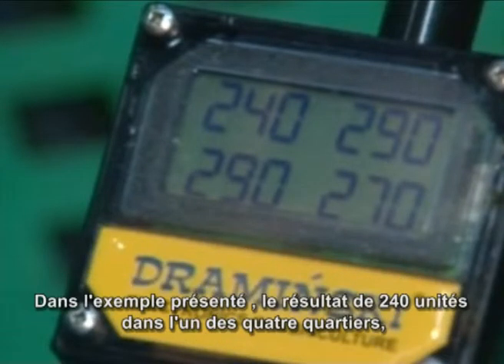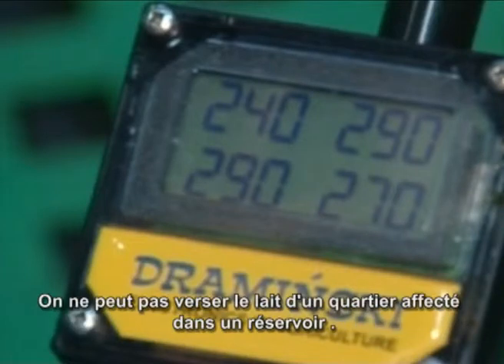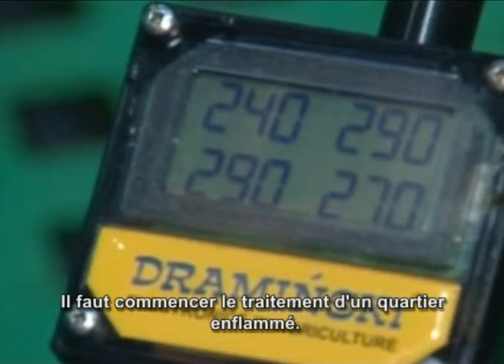Simply squirt the first of the cow's milk from the individual quarter into the measurement cup and press the on/off button. In the example shown, the quarter reading 240 gives a clear indication of subclinical or impending clinical mastitis. The milk from this quarter should not be allowed in the bulk tank, and the quarter should be treated for mastitis.